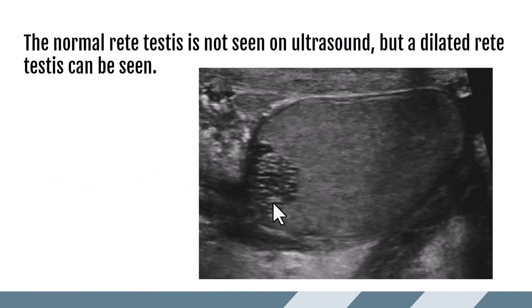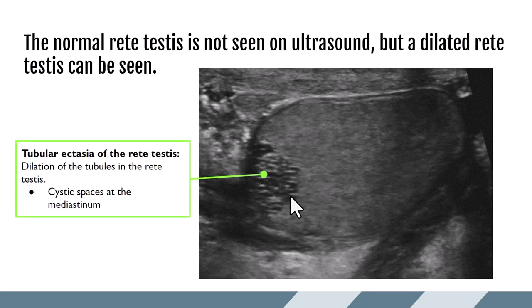Normally the rete testis is not seen on ultrasound, but dilated rete testis can be seen in the area of the mediastinum. This is known as tubular ectasia of the rete testis, presenting as dilation of the tubules as this area exits the scrotal hilum heading toward the epididymal head. You'll see cystic spaces at the mediastinum.